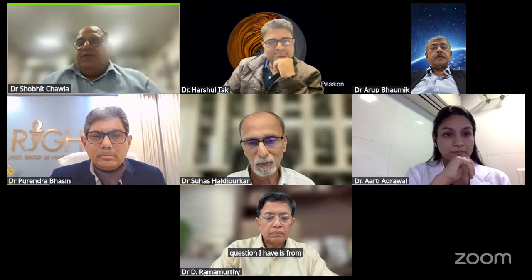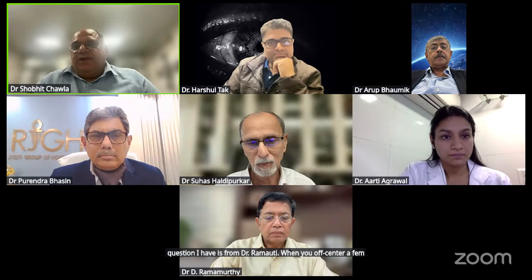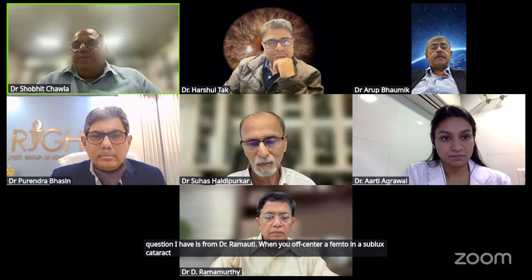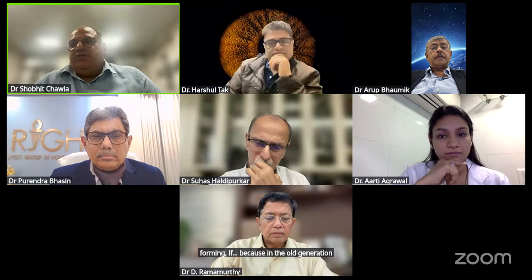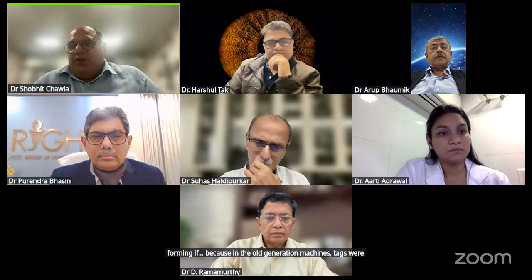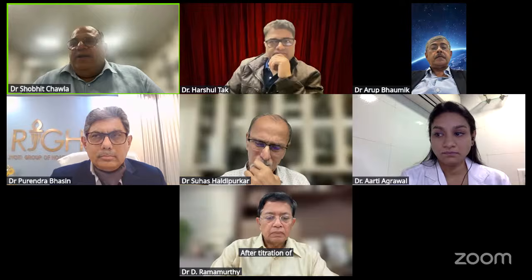The second question I have is for Dr. Ramamurthy. When you off-center a femto rhexis in a subluxated cataract, how do you feel about the strength of the rhexis for implanting a CTR? Do you ever see radial tears forming? Because in the old generation machines, tags were an issue. In the new generation, after titration of power and timing, I'm finding it not an issue.